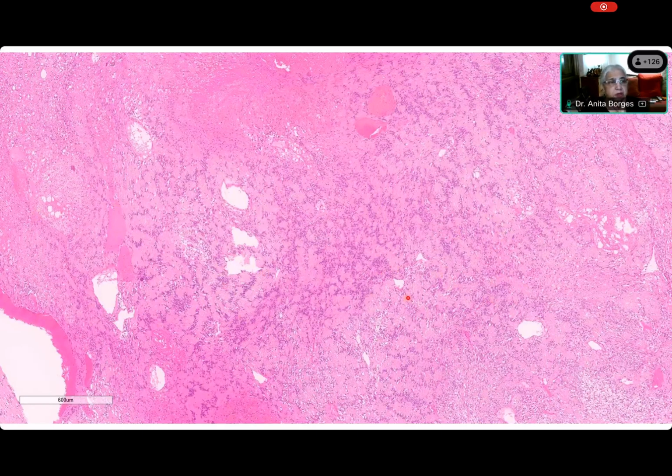Anyway, I know what you were showing me. I will do it. You are saying that these are hypocellular areas, right? All these? Yes? Is that what you're saying, Saida? Yes, ma'am. All these are hypocellular areas. Everybody agrees that these so-called hypocellular areas are Antoni B? No, ma'am. No. So one of you tell Saida what is wrong. Yes, Deepali. Why are these not Antoni B areas?